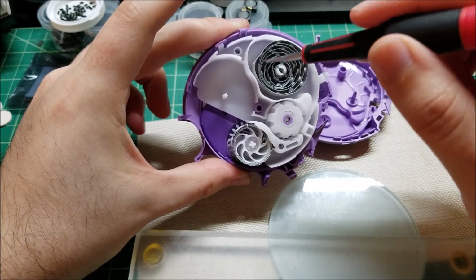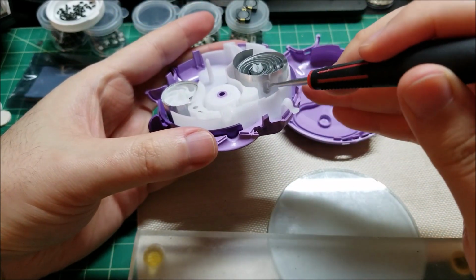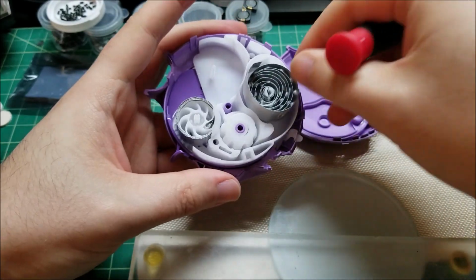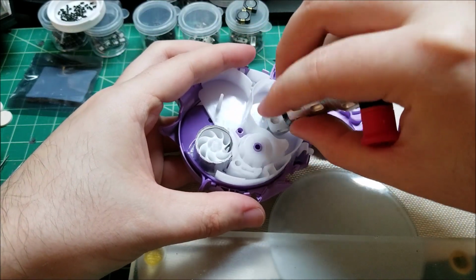over. And once you start using it, this is kind of the spent, you can see they're like little capsules on the foil. And try to pull this out. Yeah, there's quite a number of them because this is all the doses that were used.